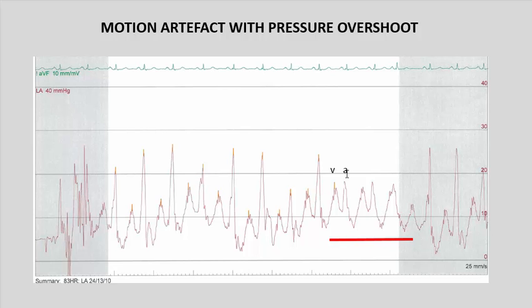And again, the computer does it automatically, but you line up your A waves with your P wave just after and your V wave with your T waves. This would be a left atrial trace. So it's aligned very, very nicely without any time lag difference between your ECG and your actual physical recordings of mechanical pressure deflections. This is LA on a scale of 0 to 40, again in sinus rhythm. Always take note. And that would be a normal value where the mean would be somewhere around 12. That's totally acceptable within a normal range.